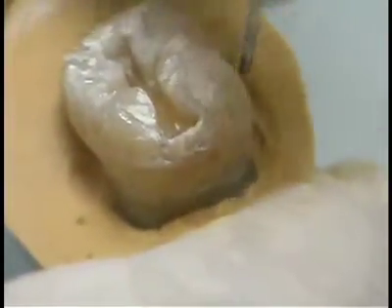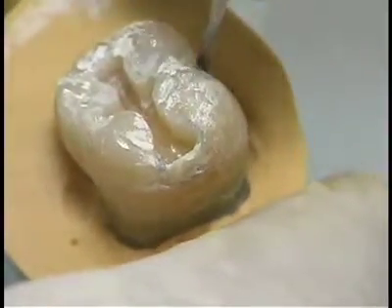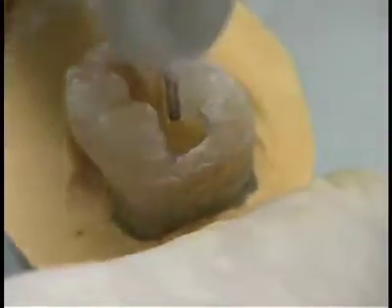Due to the morphological shape of the tooth and the contact area, the buccoproximal wall on the mandibular molar makes an acute angle with the gingival floor, and the linguoproximal wall makes a less acute angle.